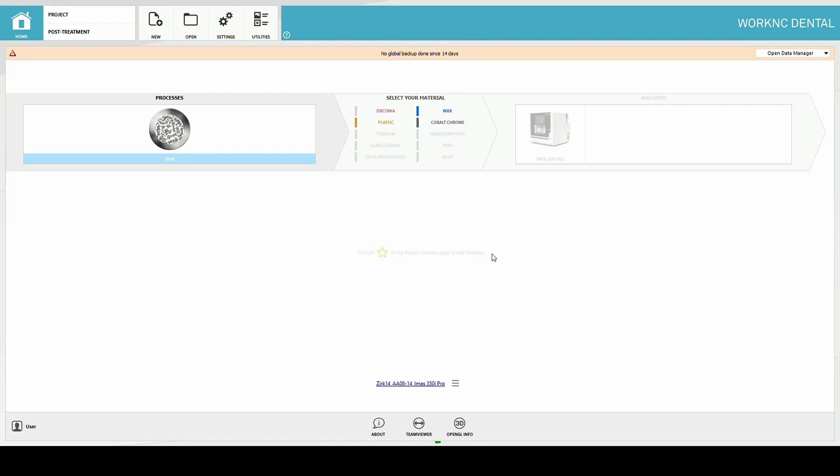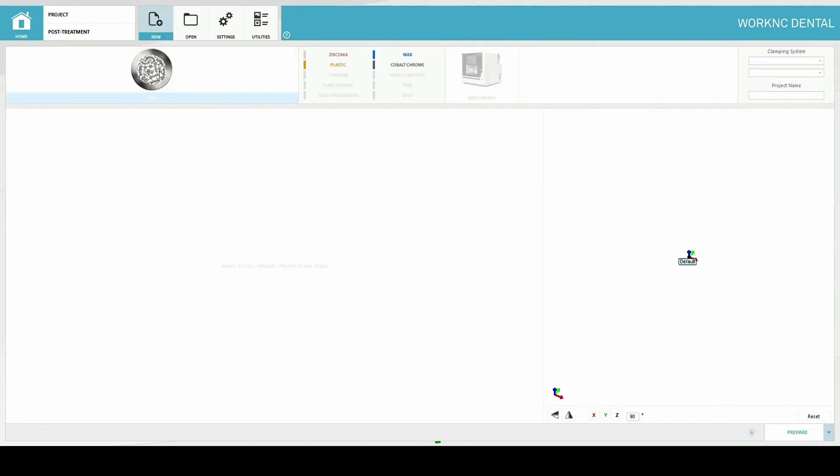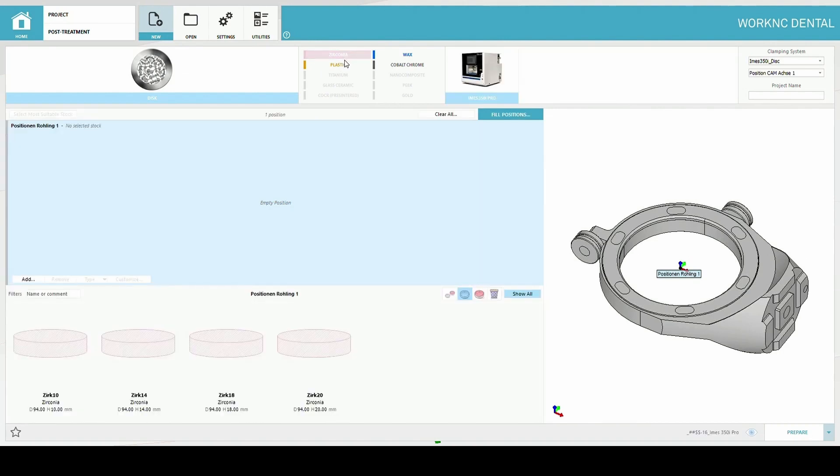Create a new project. Select the process, material, and machine you want to mill the matrix restoration.